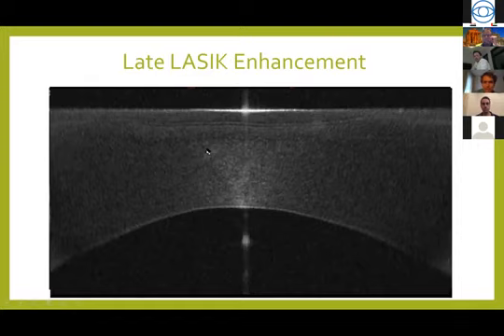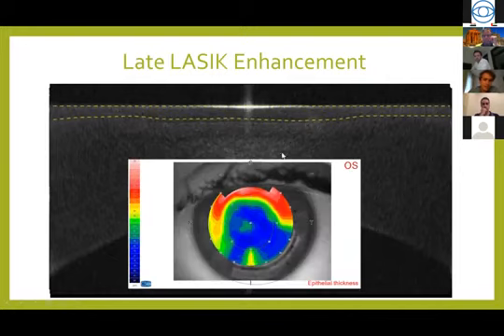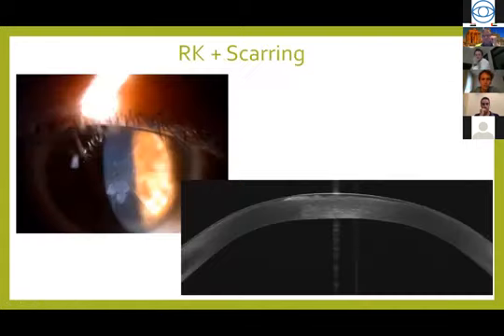And again, here, you can still understand the epithelial remodeling, about how the epithelium has got thicker in the area of ablation, okay? That is the typical sign that has been already demonstrated after a myopic ablation, how the epithelium gets thicker in the center. Okay, and here you can not only see the map, but also you can see directly what is going on and understand what is happening.